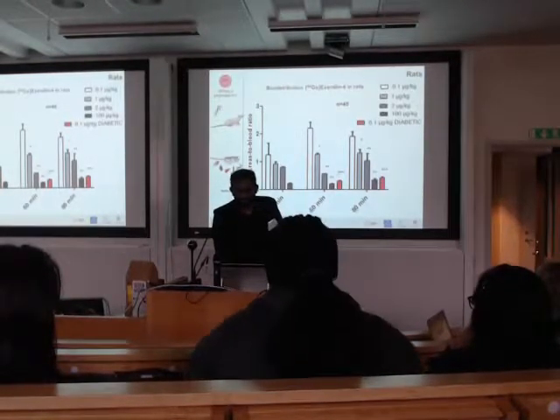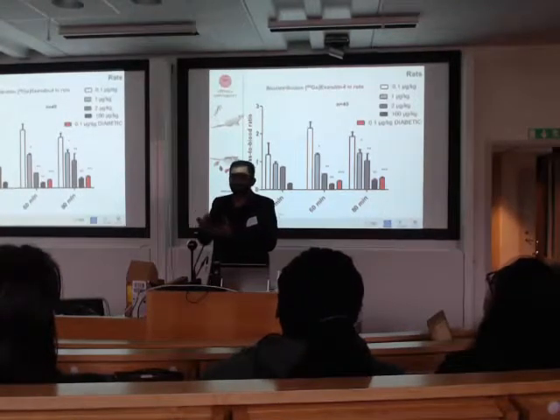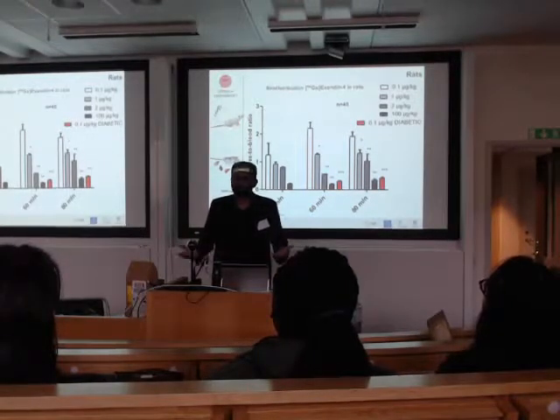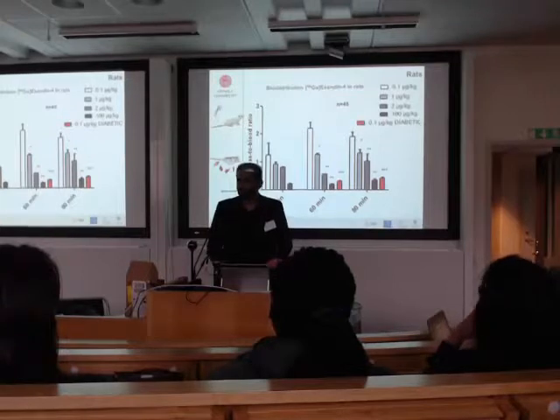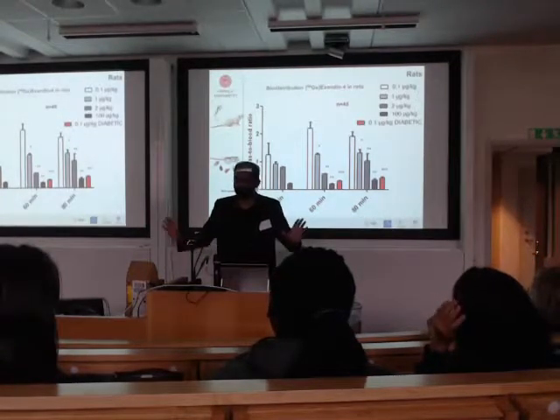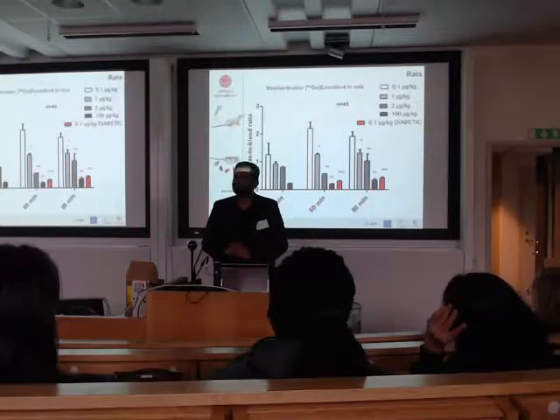And then we also worked on a diabetic animal model. Long story short, a diabetic animal doesn't have islets. If your tracer is binding to islets, you shouldn't see any uptake in the diabetic animal model. Easy to understand? So you don't see any uptake in the diabetic model. So it was bombastically fantastic until here. Rats, we're all happy. But do you think this is good enough to take this tracer to the clinic?